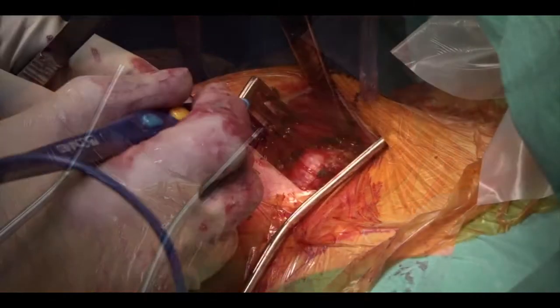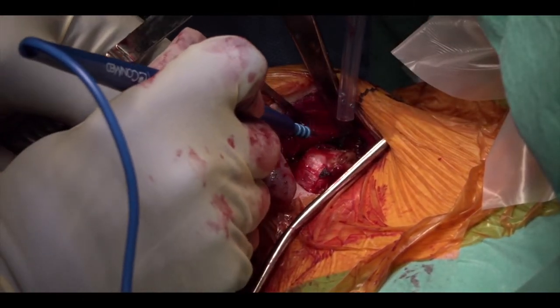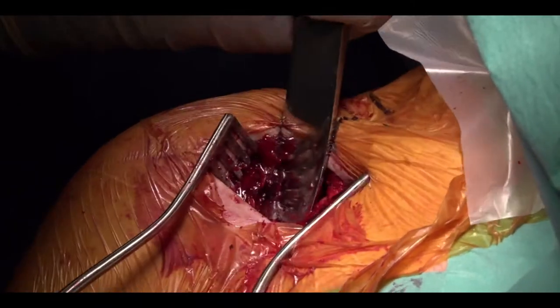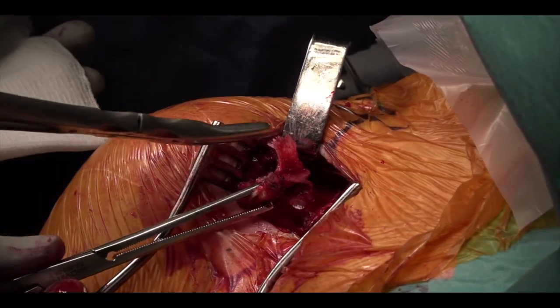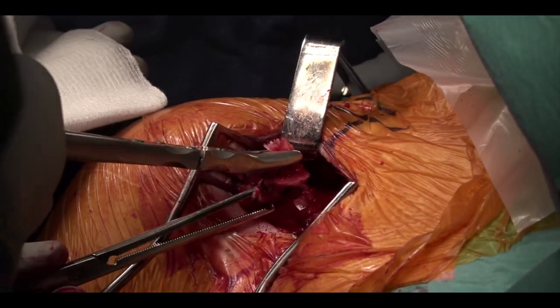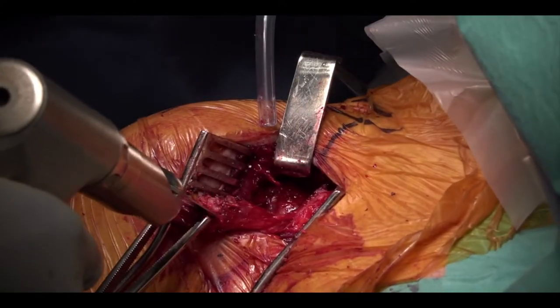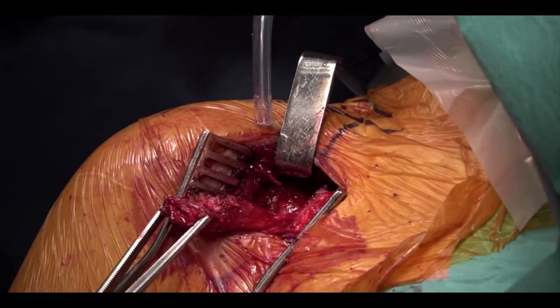The coracoacromial ligament and the pec minor have been taken off and the top of the coracoid is being prepared. The osteotomy is then performed using a curved osteotome. The sliver of the elbow of the coracoid is then removed and the undersurface of the coracoid is decorticated to expose a nice bleeding cancellous surface.